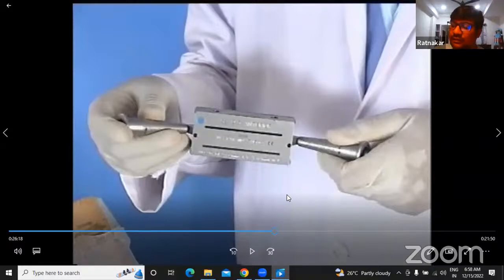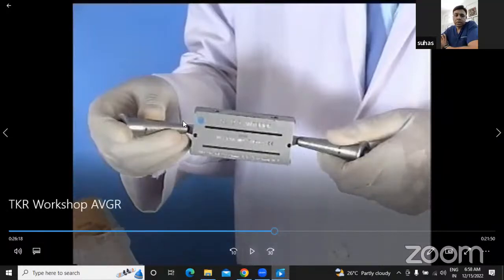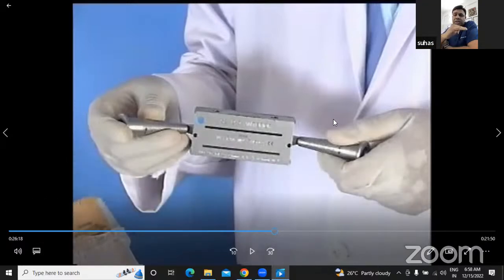Suhas, sir, there is one question also. How to get a pre-op idea for external rotation that should be set on the jig? So the amount you're externally rotating, you should know the purpose of that. One is you want to stay anatomic and parallel to your TEA. The reason you would externally rotate more is if you have a tight medial flexion gap. That is the only reason we would do that. So that should guide you further.